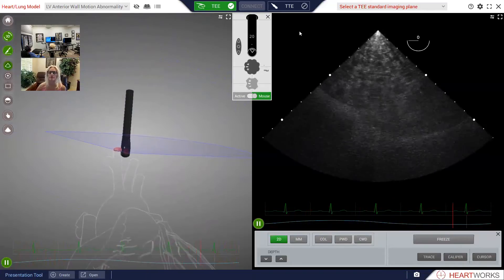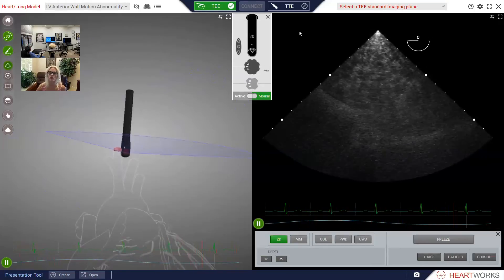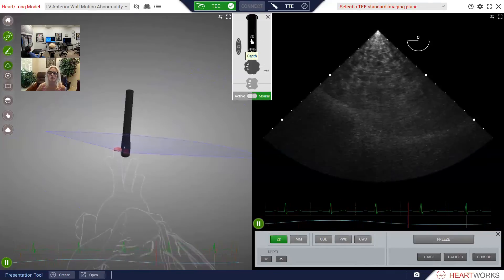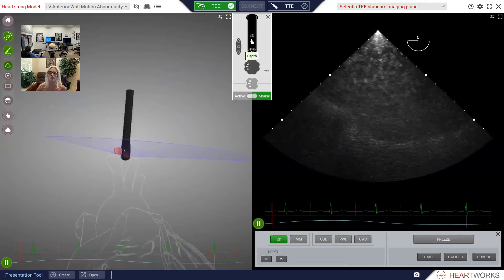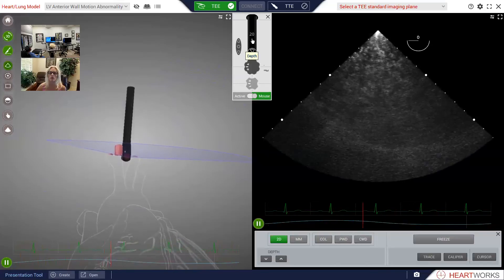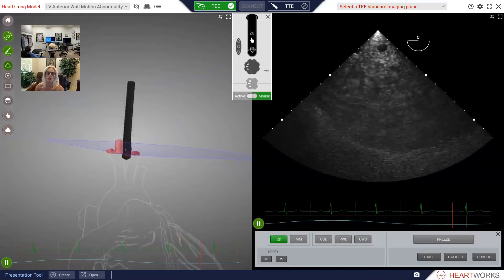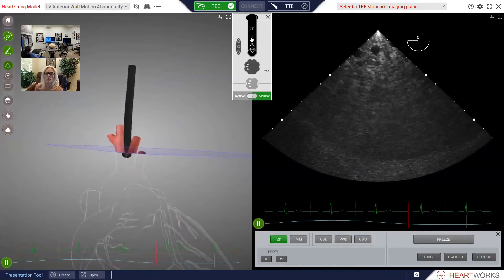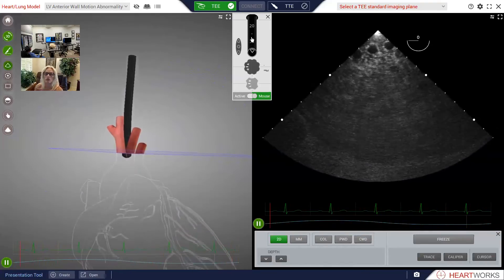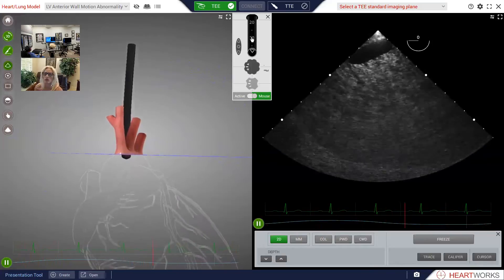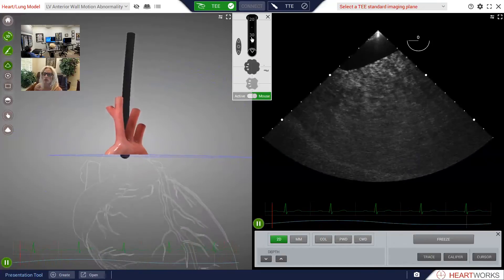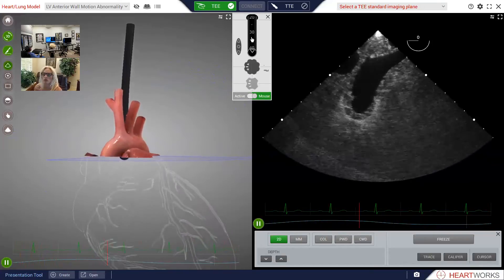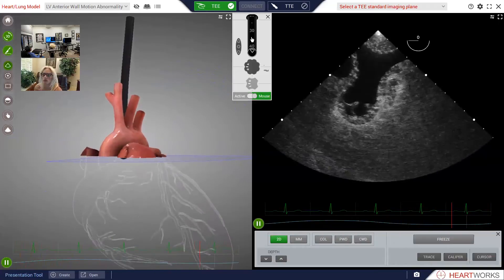Dr. Durdall, I'm going to let you have control of the probe now. If you'll click on your mouse once, you'll have control of the probe. Let's slowly insert it using the mouse cursor and the mouse wheel, and as we insert it we'll just go through the views as a summary. Here are the great vessels of the neck, the innominate arteries on the left sector. Here's the upper esophageal view with the aortic arch and long axis.